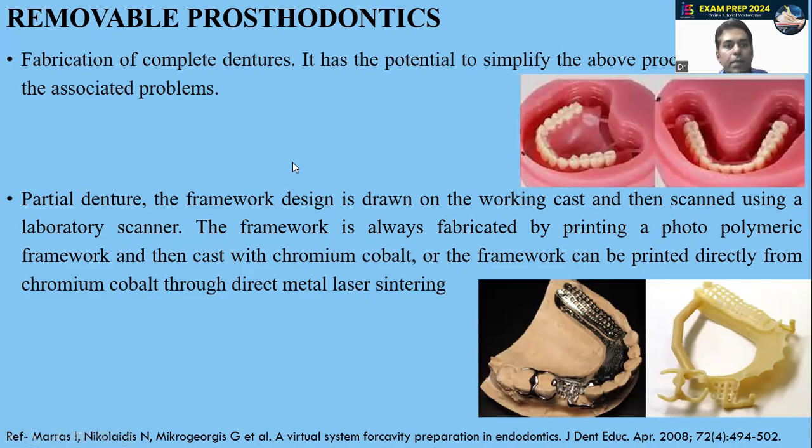Now, regarding application of CAD CAM in removable prosthodontics. Fabrication of complete denture: it has the potential to simplify the complete denture fabrication process and resolve the associated problems. And comparatively, it will require fewer appointments. When we fabricate a complete denture in a conventional manner, we need at least 5 appointments. But when we are fabricating with the help of CAD CAM, the number of appointments will be less as compared to the conventional complete denture fabrication process.